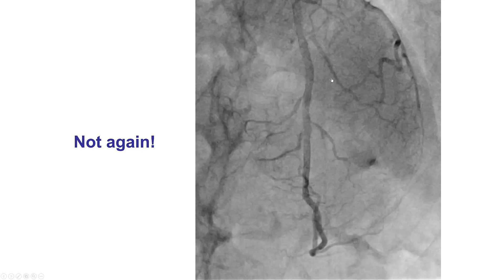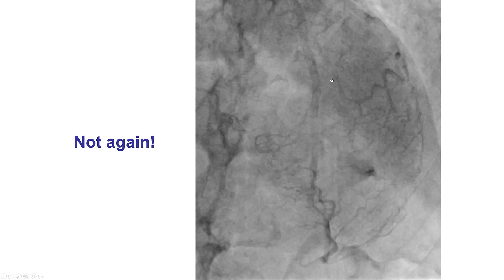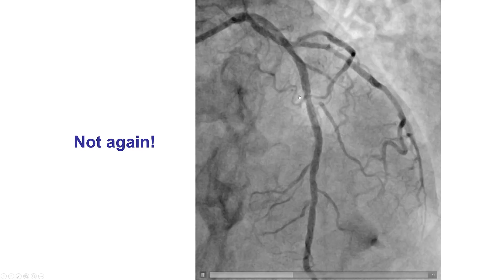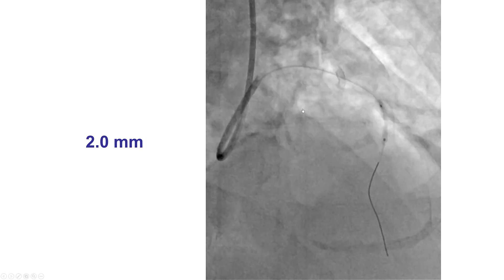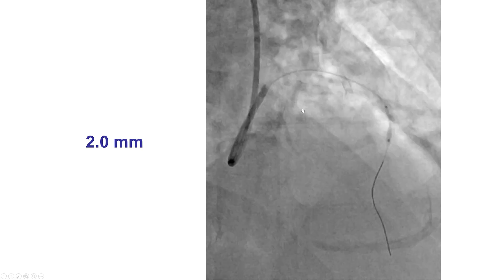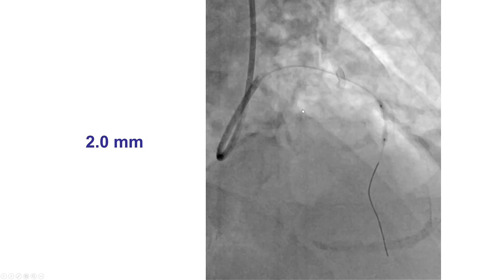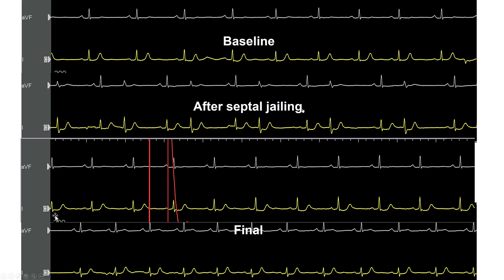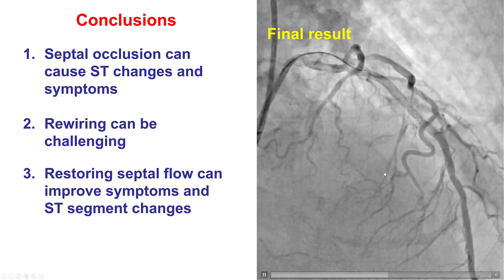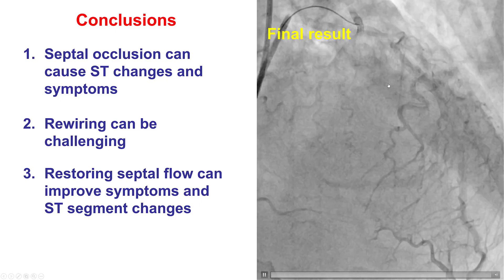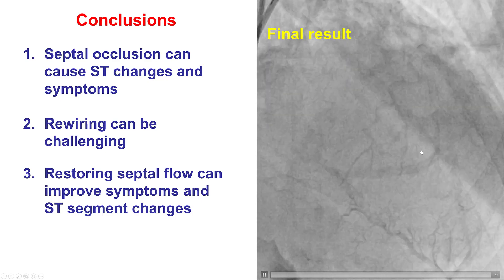Unfortunately, the proximal optimization resulted in reocclusion of the septal branch. As a result, we rewired and performed one additional inflation with a 2.0 mm balloon. That resulted in resolution of the EKG changes and also restoration of flow into the septal branch.